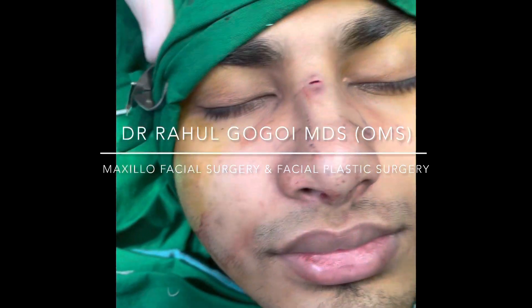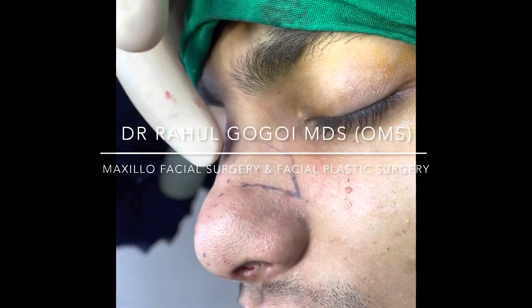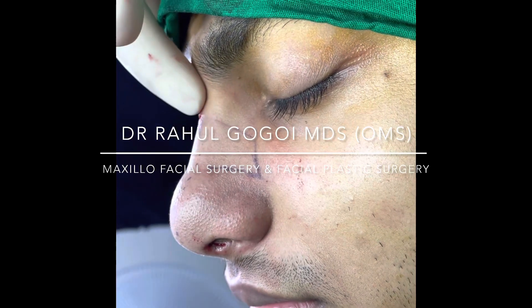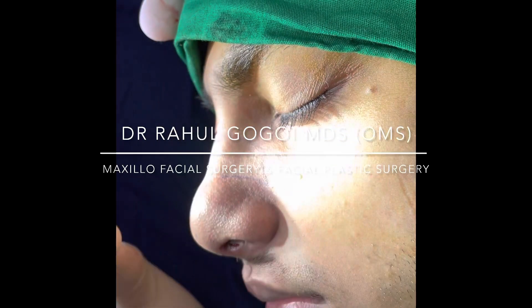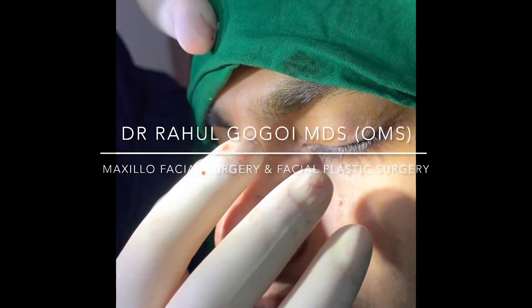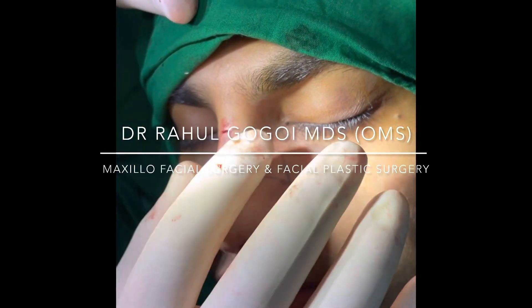If you see from the side, you can see there's no hump here — it's completely straight. The advantage of doing preservation rhinoplasty is that we preserve the shape of the dorsum of the nose, so there are no changes in this particular shape. It's a very nice, very smooth shape.